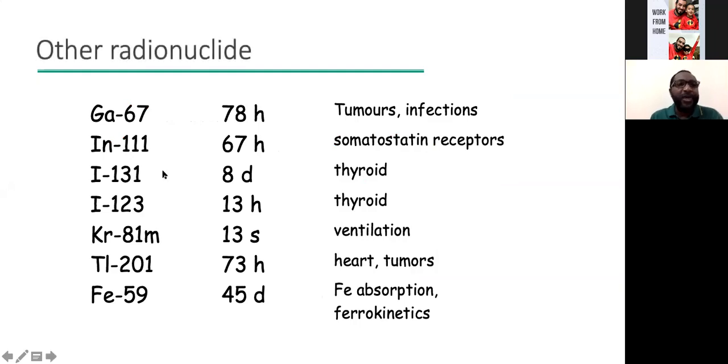So if you look at these, these are other radiopharmaceuticals, like I mentioned earlier, that do not need tagging. One of them is gallium-67. This has been used previously, no longer used again. It's been used for tumor and infection imaging. Then we have radioactive iodine-131. Again, because it's a radioactive iodine, this is an active substance that does not need tagging. So all these radiopharmaceuticals in this table, you don't need to do the normal tagging process. On their own, they can serve as pharmaceuticals.